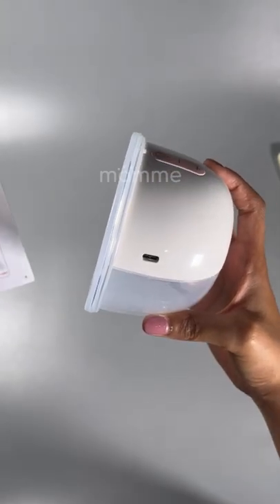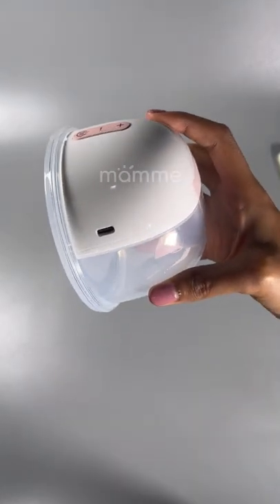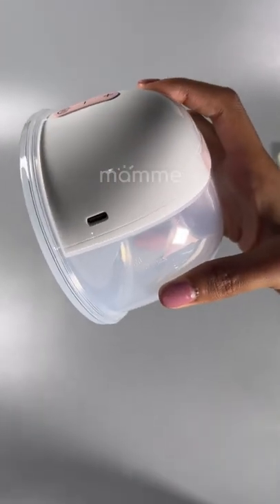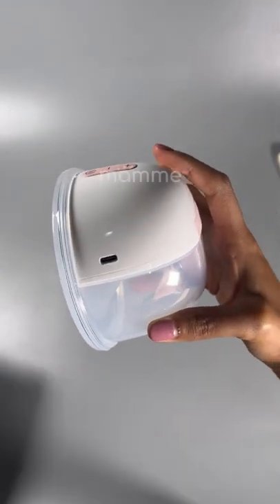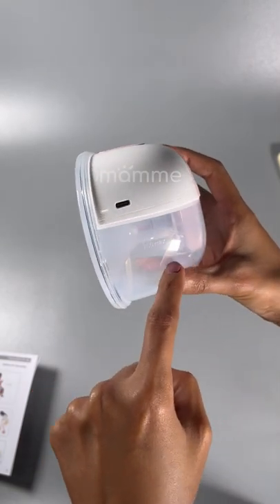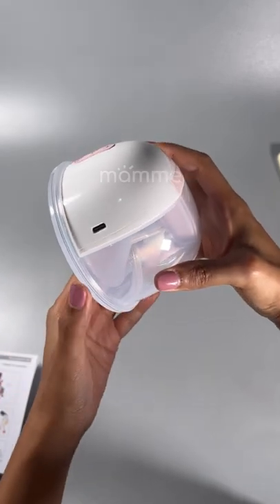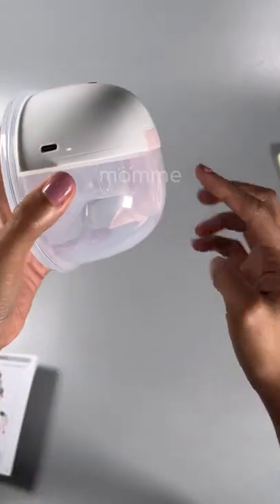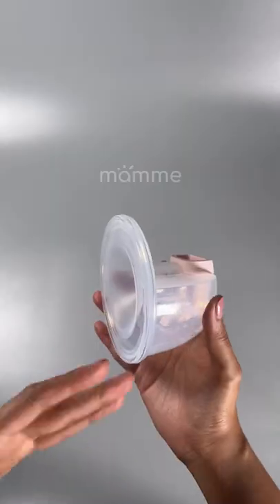So, what else ang magkakos ng leak? Kapag gawin mo yung opposite, kapag nakaganon yung pump. So, kailan to nangyayari? Kapag nakahiga, syempre yung ibang mami gusto mag-pump na nakahiga, hindi siya pwede. Or, nakaslant palikod. Kasi, remember, dapat yung milk needs to go forward to the membrane and down to the valve. Okay? So, talaga magbabackflow to ng paganito kung wrong ang position mo. So, remember ladies, how do we make sure that there is no backflow? This portion needs to be lower than the funnel. Ganon.